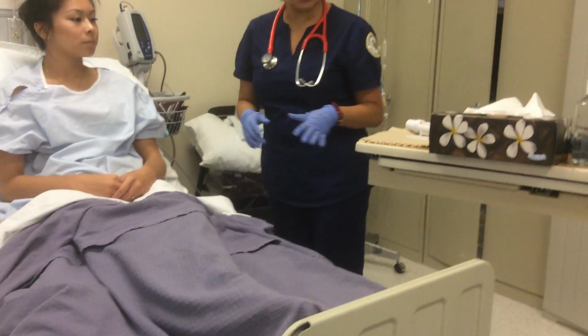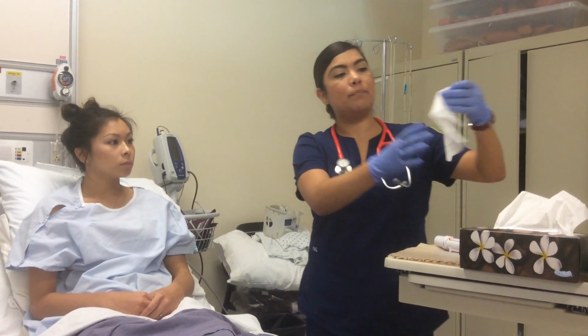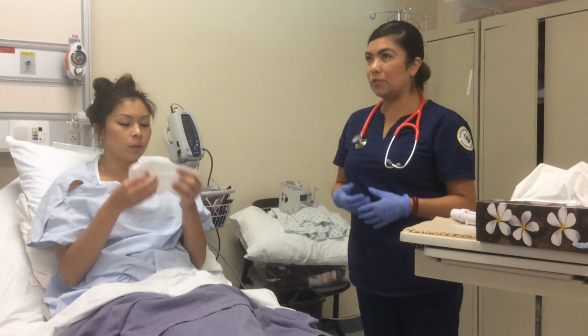Okay, perfect. So then I'm going to go ahead and do you think you could provide another cough for me, please? Okay, so you could just cough right into that for me, please. A nice strong cough. Go ahead and breathe in.